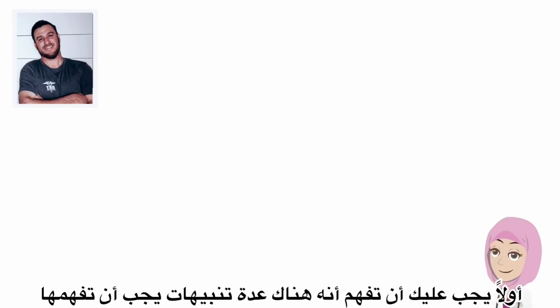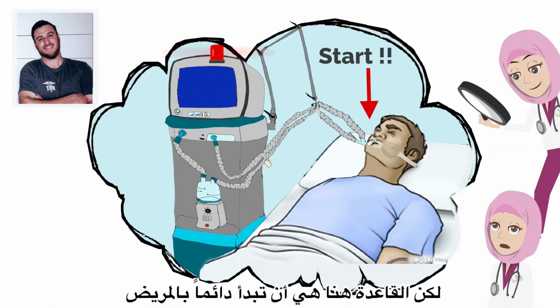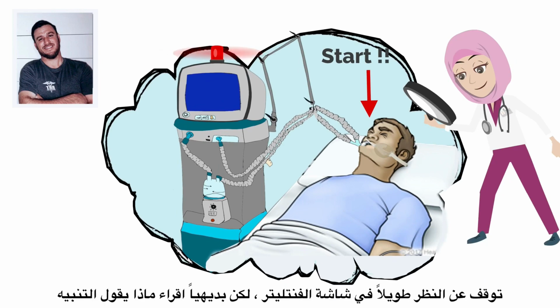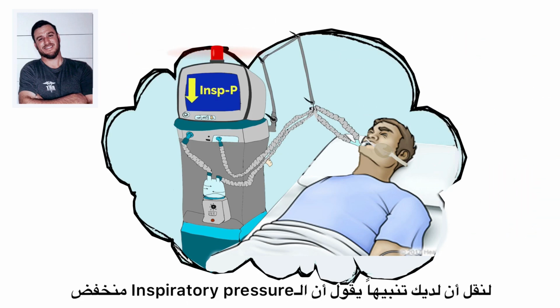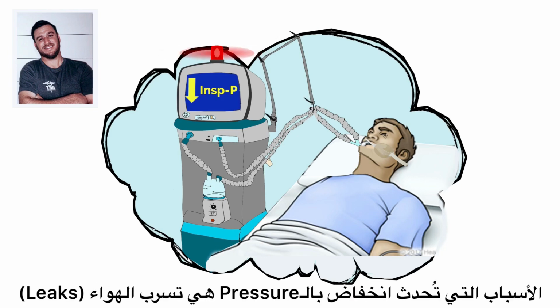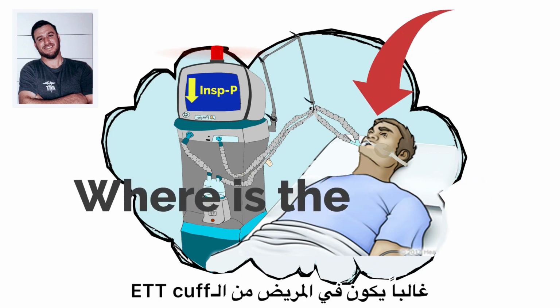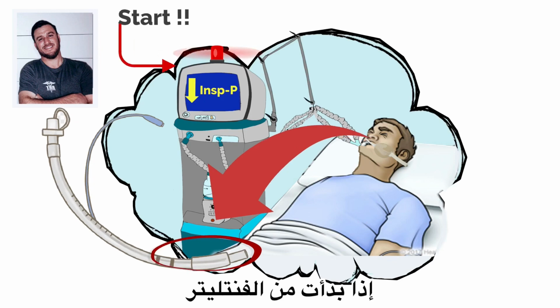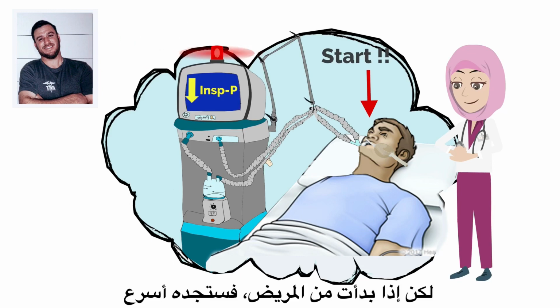So here's the key. First of all, there are lots of alarms that you need to understand. But the key is to always start at the patient. Stop looking at the ventilator screen. Obviously, read what the alarm is. But let's say you get an alarm that says low inspiratory pressure. You get your low pressure alarm. Well, things that cause a low pressure alarm are leaks. So where's the leak? Well, chances are it's probably at the patient's endotracheal tube cuff. Now, if you start back at the vent, you're going to have to work all the way to the patient before you find this leak. But if you start at the patient, you will find it quicker.